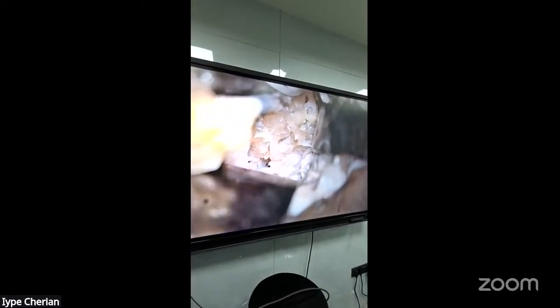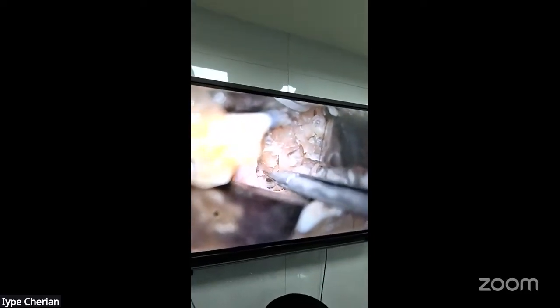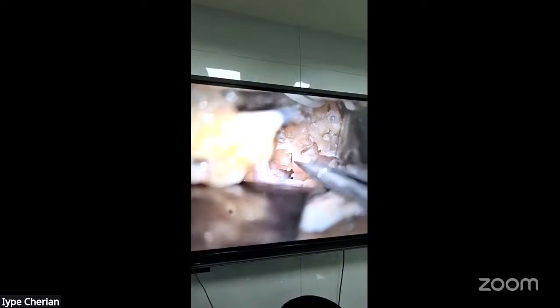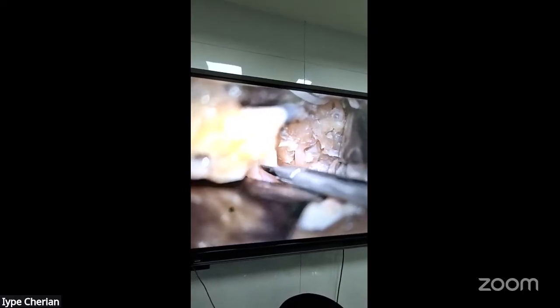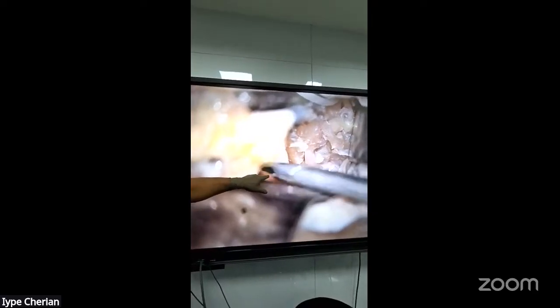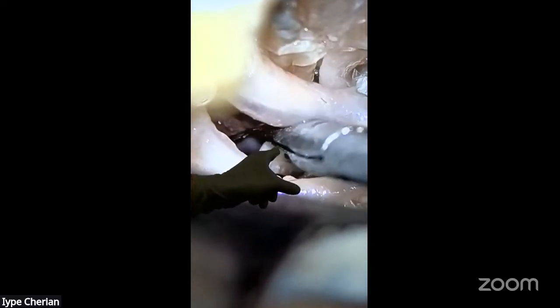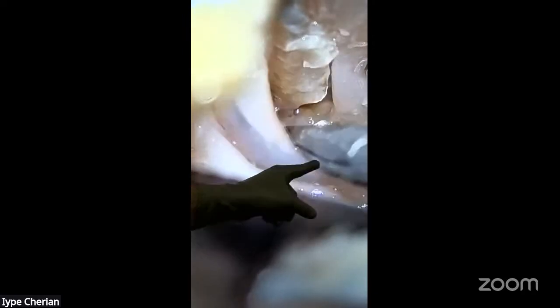So you can see now. Optic, carotid. This is optic, a little bit out. We can zoom if required. Yes, this is optic here. This is IC here. You can see the bifurcation here, and this is a basilar. That's a basilar here. That's a carotid. This IC bifurcation.